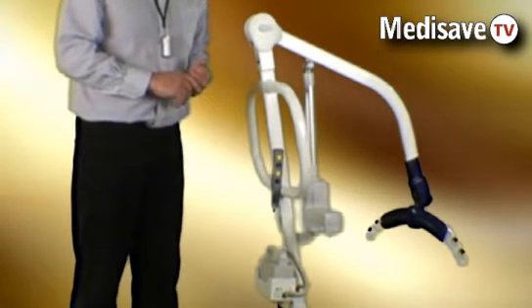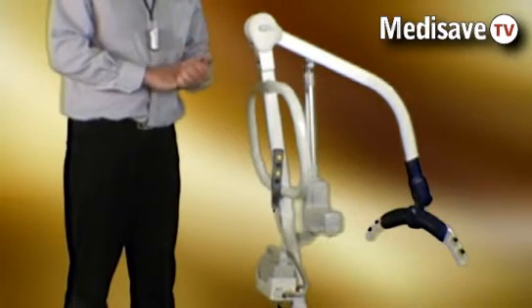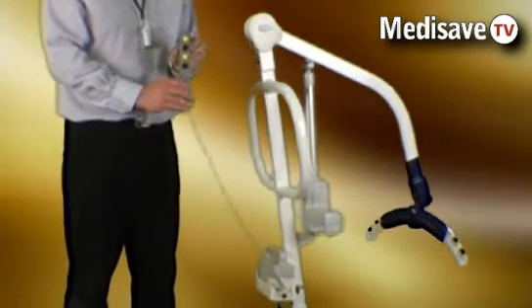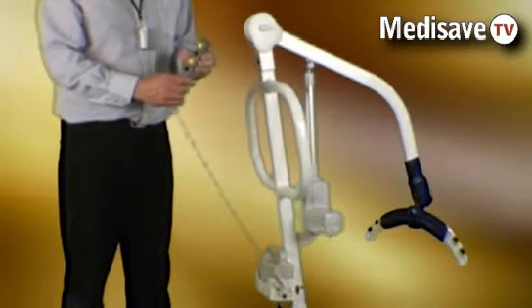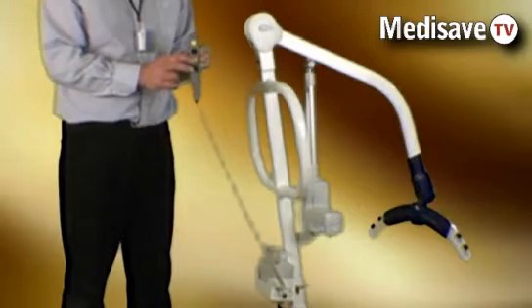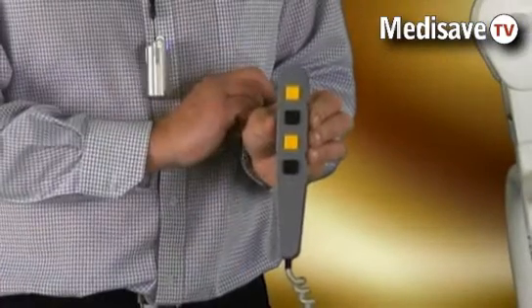The safe working load of this hoist is 25 stones or 160 kilograms. The hoists themselves are controlled using a remote handset with a lift and lower button, and the leg operation is also controlled on the other two buttons.